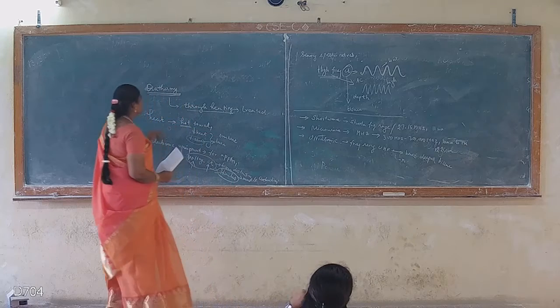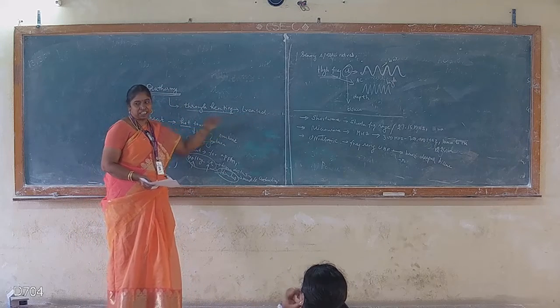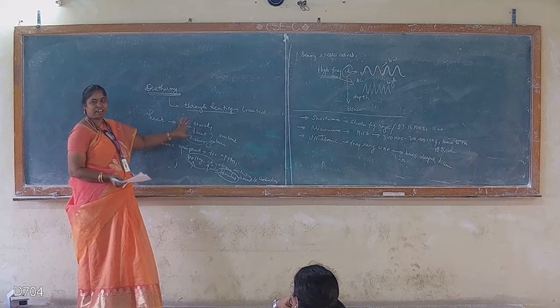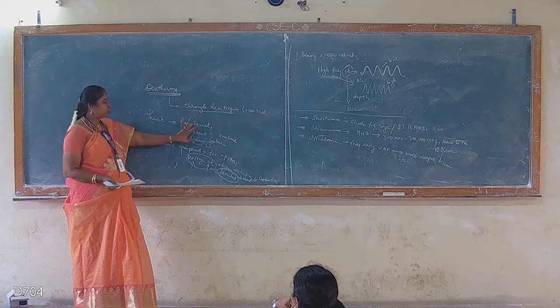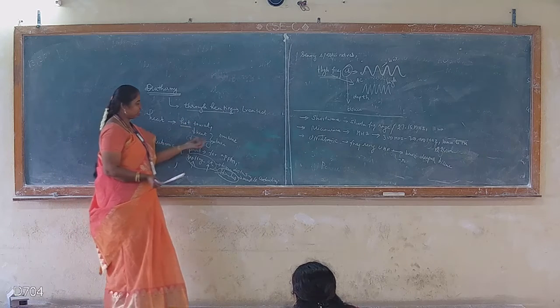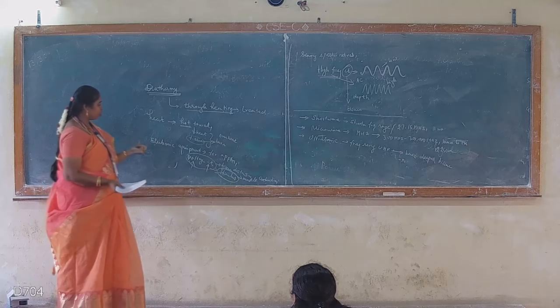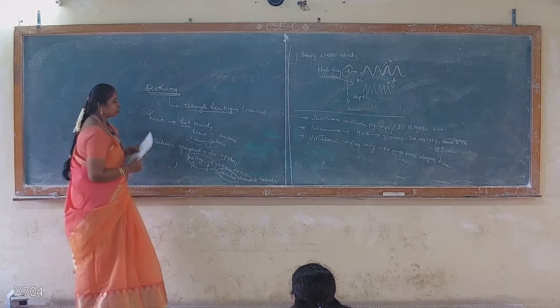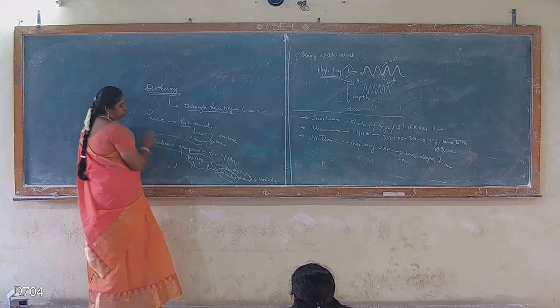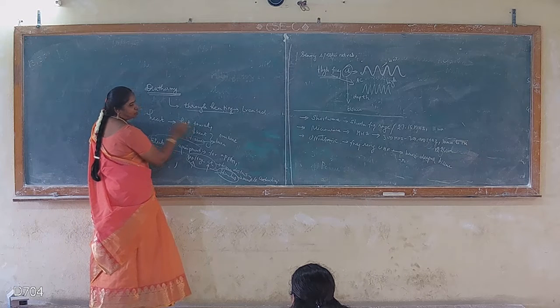Okay. So diathermy is nothing but treating something through heating. The heat can generally be applied using a hot towel. But what will happen when we apply a hot towel over the muscles? The muscles may get burned, so there will be tissue destruction. So we are trying to find an alternate method, the latest one, with the help of electronic technology. So we are going for electronic equipment for the application of heat.